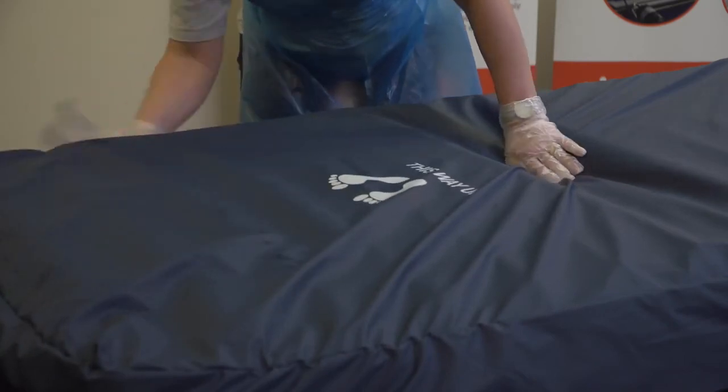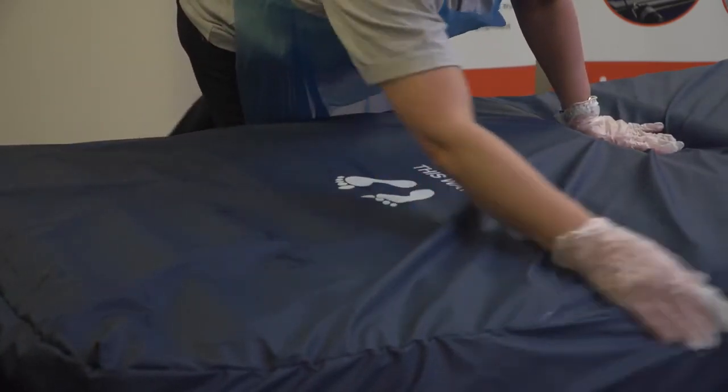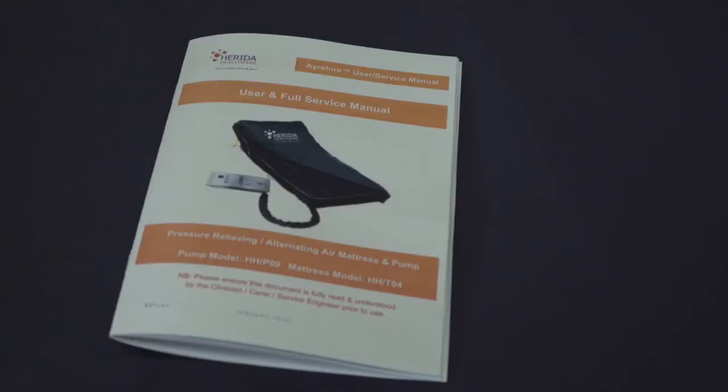Regular cleaning of the mattress is required and cleaning instructions are provided in the user manuals; copies can also be supplied on request. Maintenance and repair work should only be carried out by an appointed engineer who has been trained by Herida Healthcare. Only original manufacturer parts should be used in any repairs, as failure could affect the warranty. In all instances with any pressure-relieving products, always ensure that you seek clinical guidance and use the product in accordance with manufacturer instructions. For further information, please contact our freephone number at the end of this video or log on to our website at heridahealthcare.co.uk.